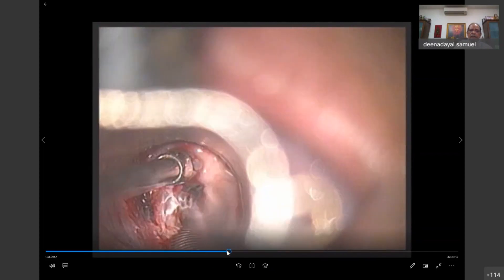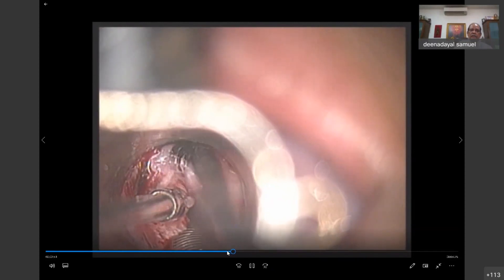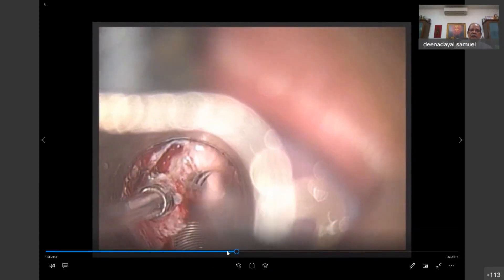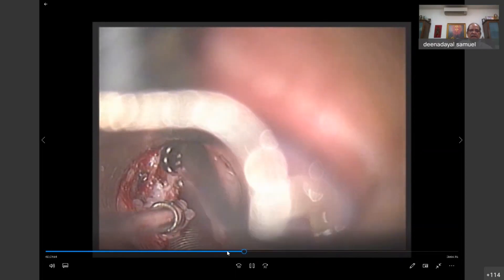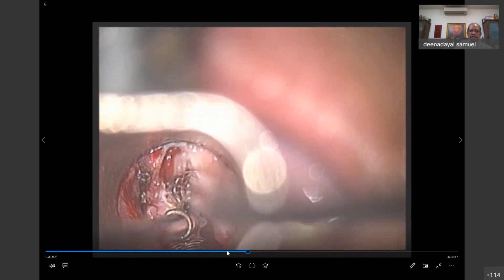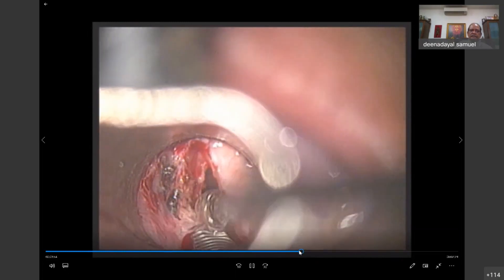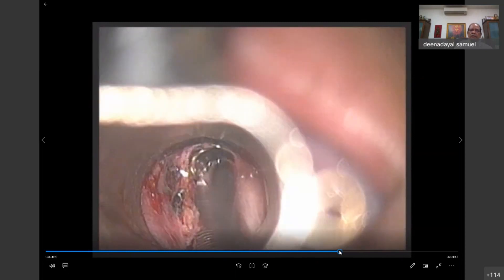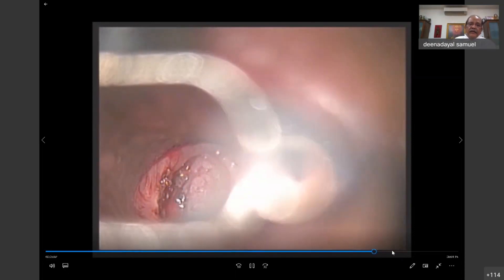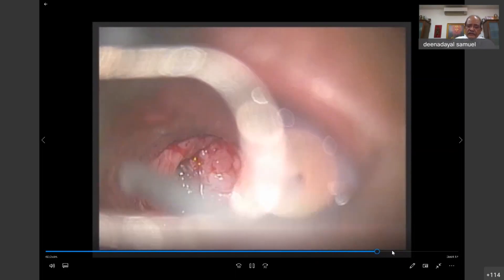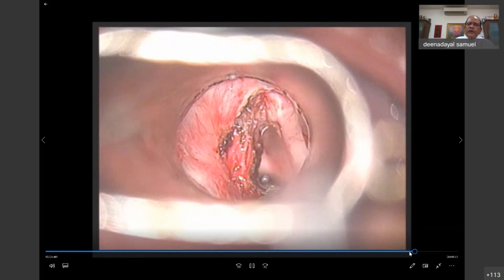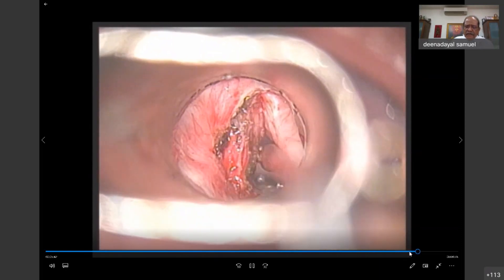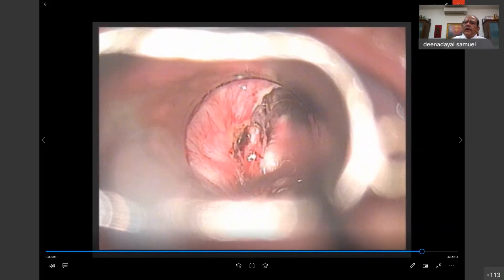You can see the right vocal cord coming into the picture. This patient had completely filled papillomas and came in with mild stridor. No tracheostomy was done — the patient was intubated and operated. In severe laryngeal papillomatosis, nothing like co-ablation; it is quite comfortable and safe. This is the final picture — the whole thing has been removed and the patient is doing well. Even recurrence rates are not much.